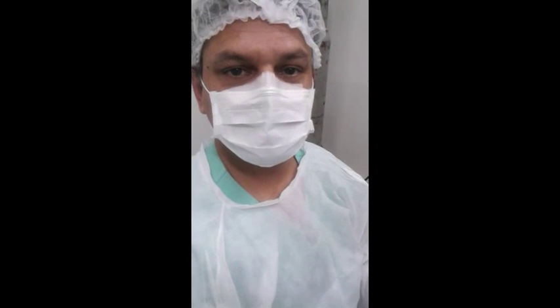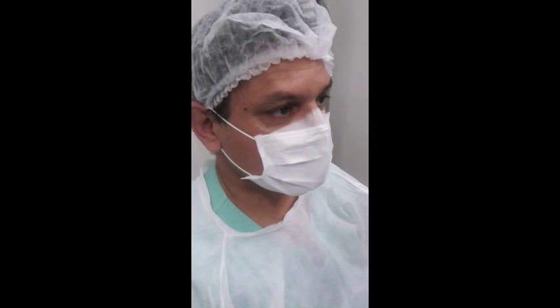Hello, good afternoon. We are here in the EyeBank Foundation of Goiás, Goiânia, and we are performing a vitrectomy for retinal detachment.